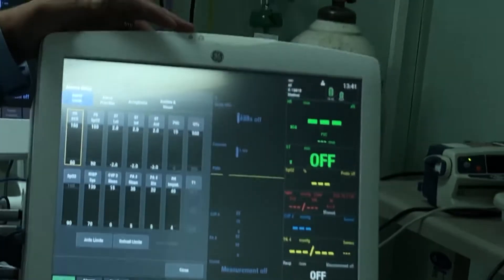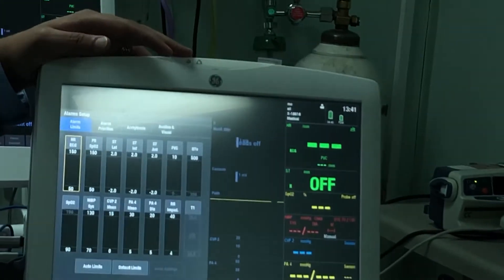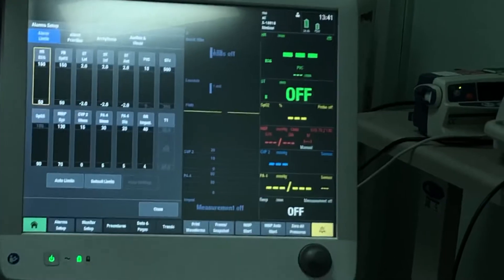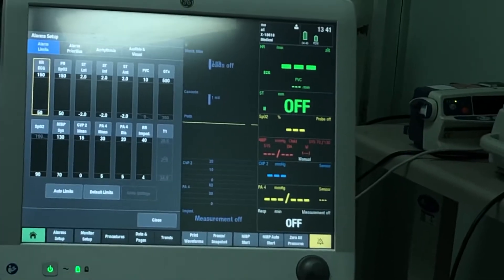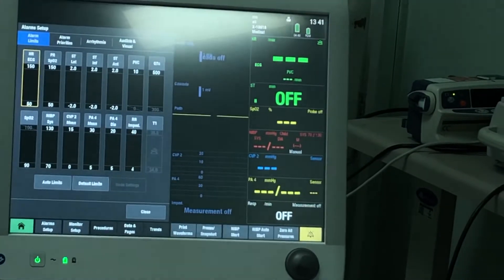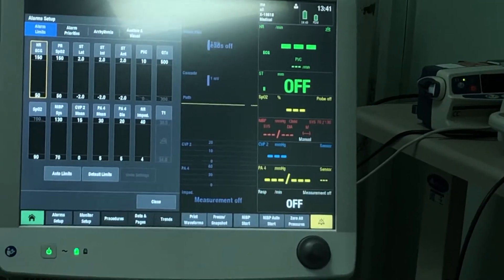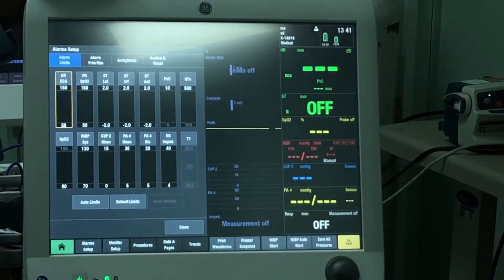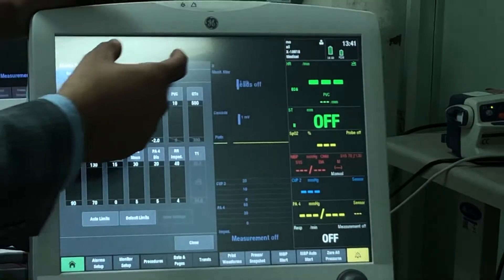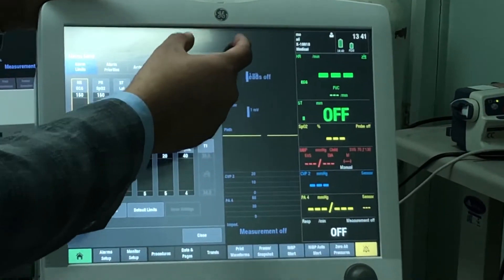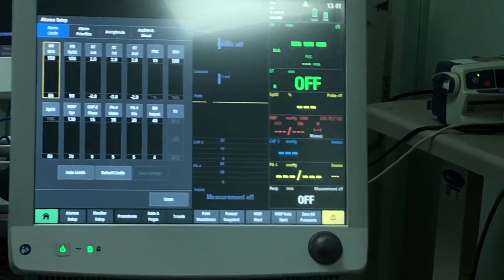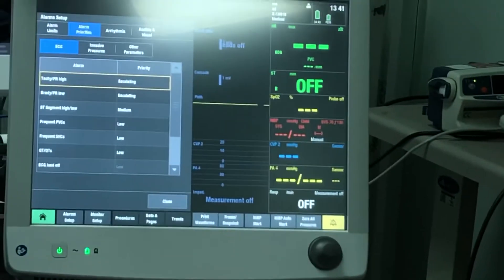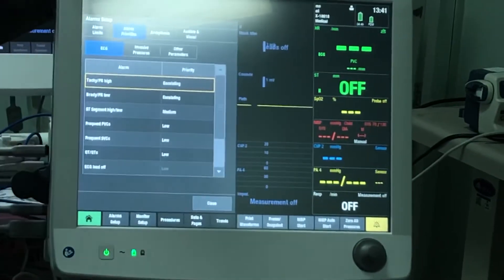The monitor will not just alarm — it will give you the diagnosis of any alarm. It will tell you this is VTAC, tachycardia, desaturation, whatever the diagnosis is. It will display the diagnosis in a box on the screen and alarm as well.